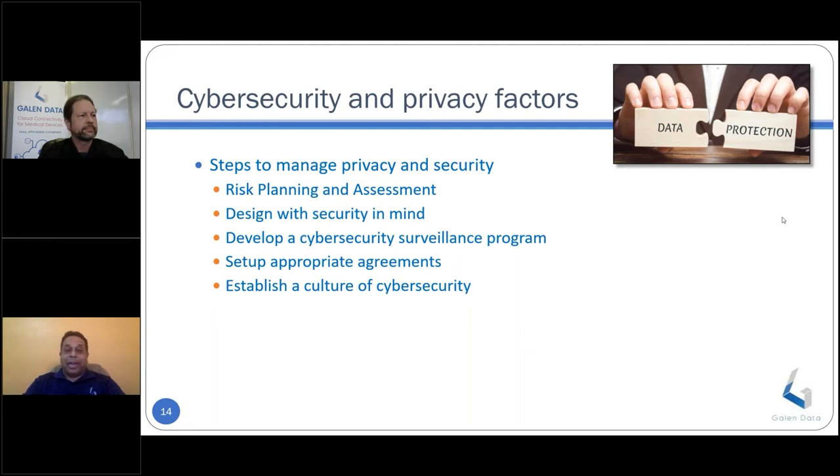You need to do security testing to make sure that your infrastructure, your connected health design aspects can withstand common attacks. And then ultimately, just like you have a bill of materials for your hardware parts, it's important to have a bill of materials for software parts. Partly because, as I said, a lot of software is built on other people's software, like open source software. Knowing which versions of those libraries, when you had it, what are the patches available, because they may have security vulnerabilities. It's important to keep track of all that stuff.